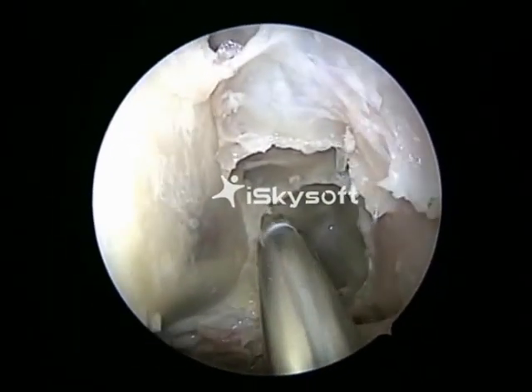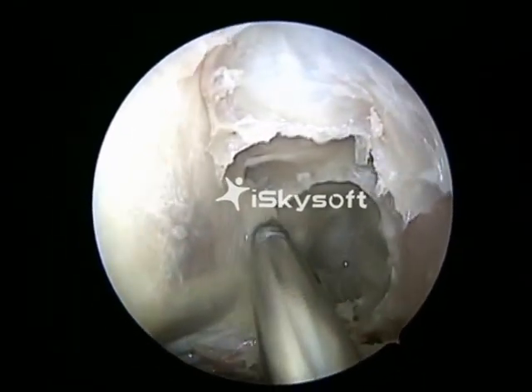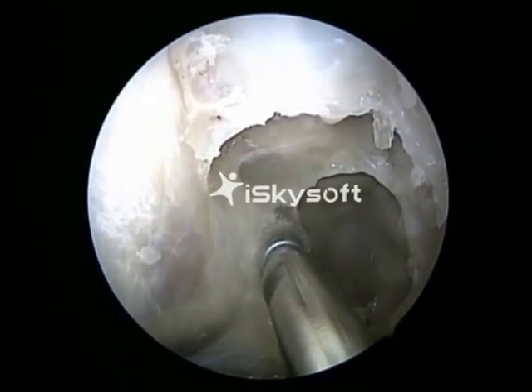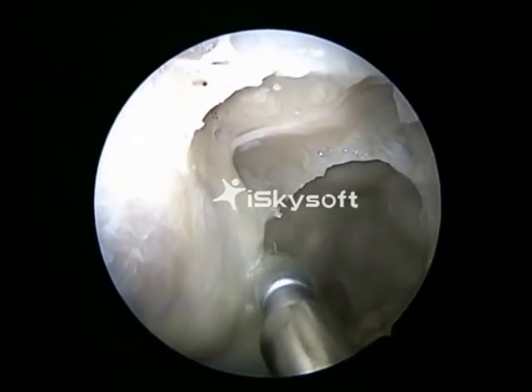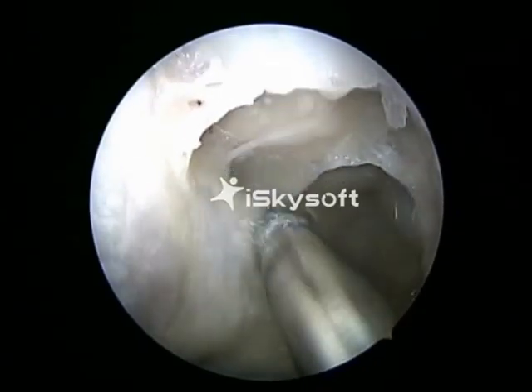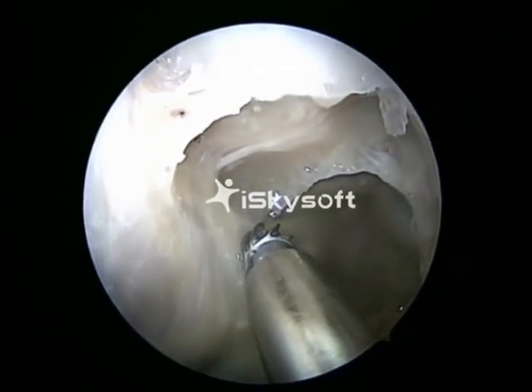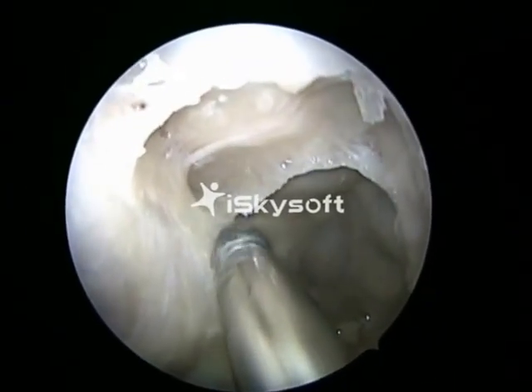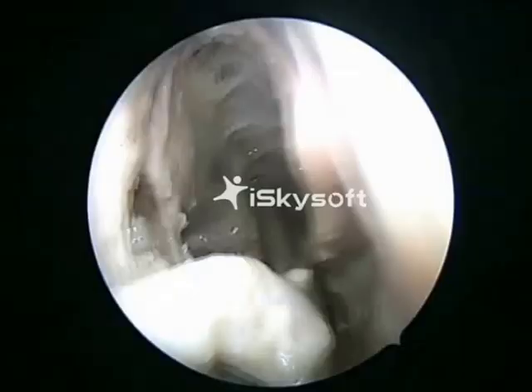In a live situation, we would like to use a diamond burr to remove the bone over the optic tubercle. But here in a cadaver, we are using a cutting burr. The bone on its medial wall is either thin or dehiscent or thick. In this situation, it's very thick.